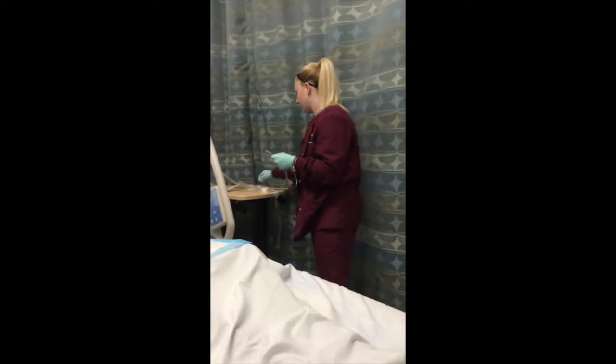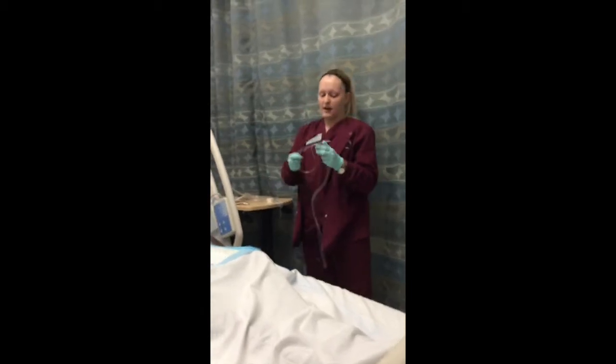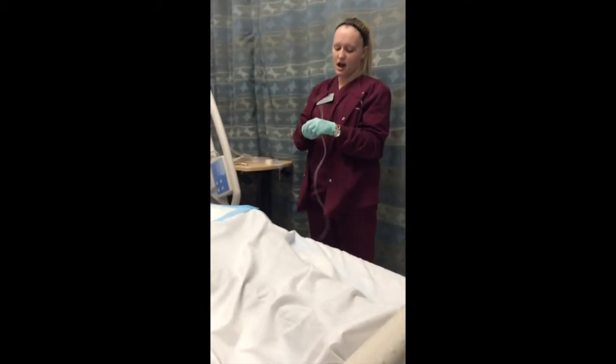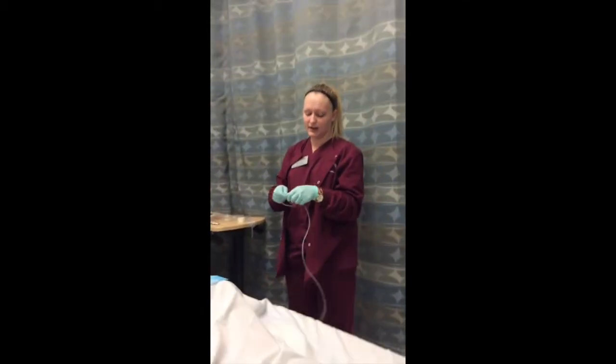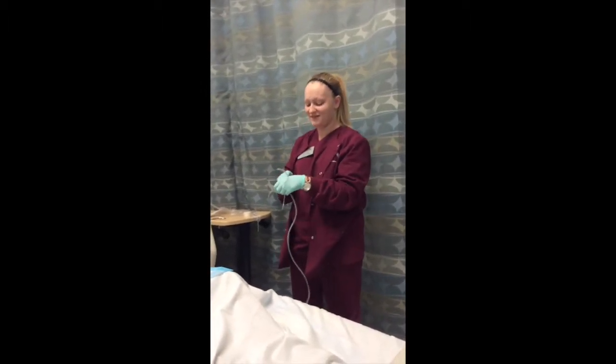Now I'm going to go ahead and get my lubrication and put it on my glove, really good, lots and lots of it. I'm going to get this real lubricated. I don't want to use this sparingly. I want to get lots on there because it's an uncomfortable procedure for the patient.